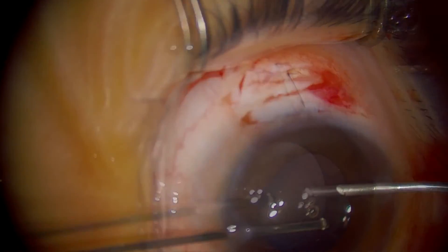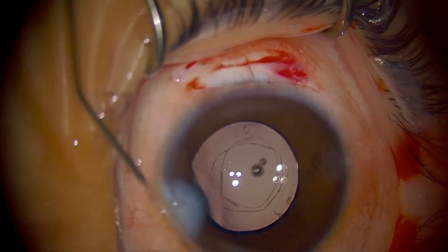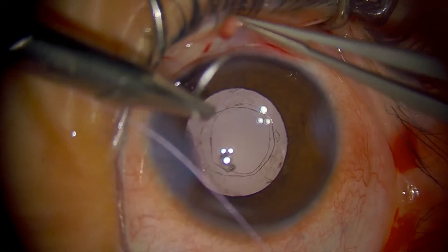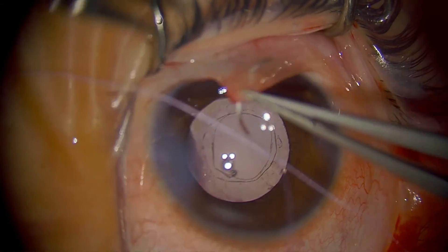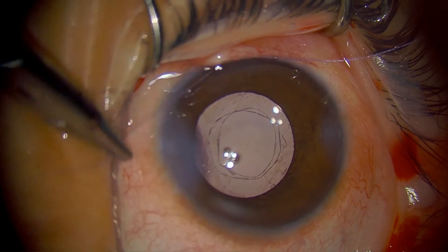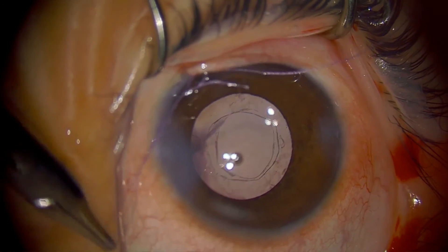If you do a good clean-out like we have done — take out all the cortical material — you should not have much inflammation. I just put them on a combined antibiotic-steroid eye drops four times a day for about two weeks, and you should get very little inflammation from this. Amblyopia-wise, depending on the age — he is eight years old — chances are he's not going to develop amblyopia, so his vision should return pretty quickly. Because we do a scleral incision without stitches on the cornea, we're not going to get much astigmatism at all.